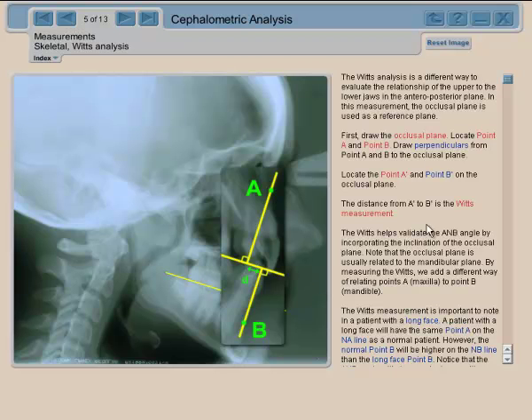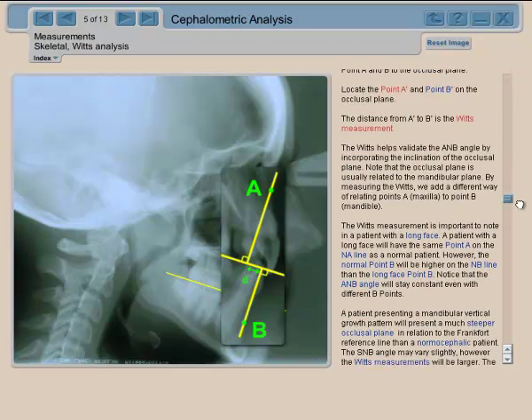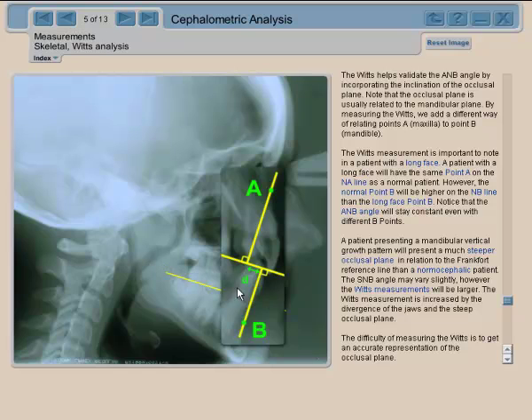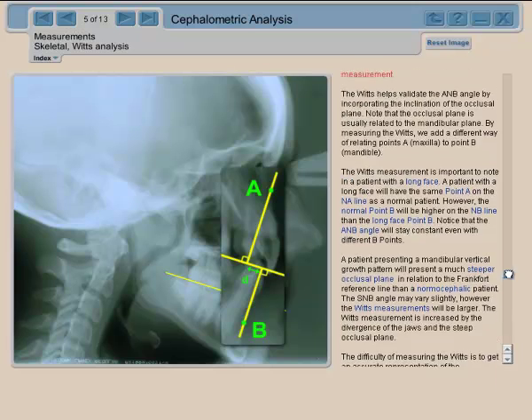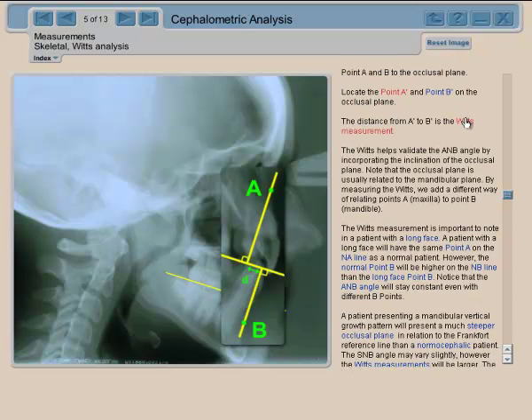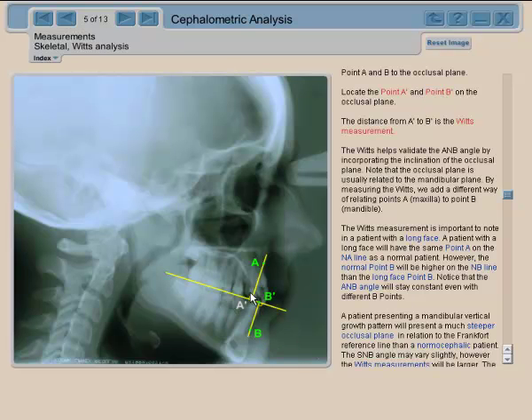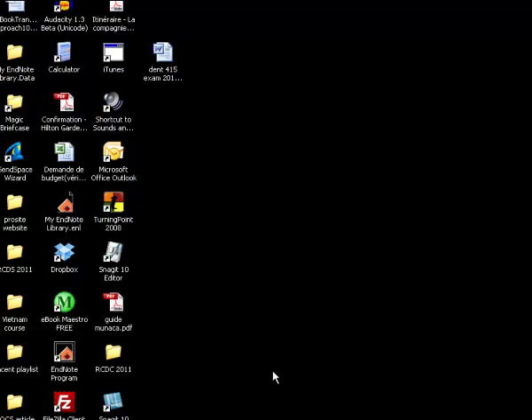The distance you see right here becomes the Wits measurement. It's done in millimeters and gives you the difference in projection between the maxilla and the mandible.